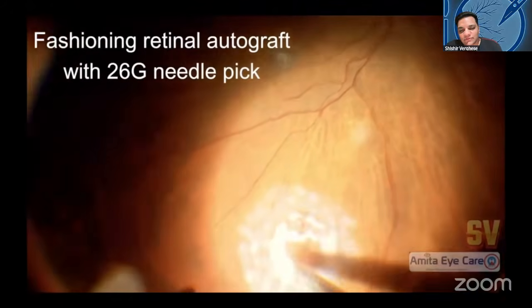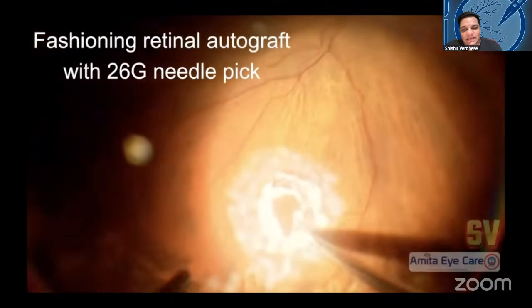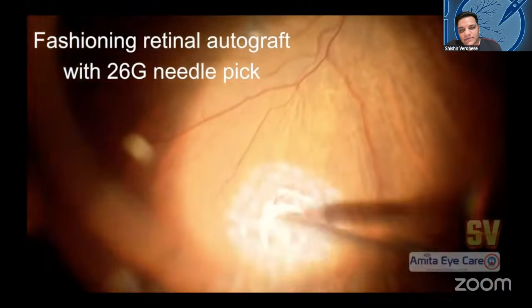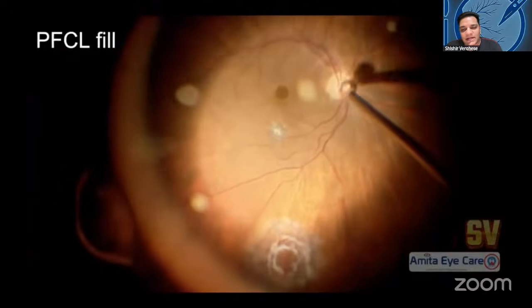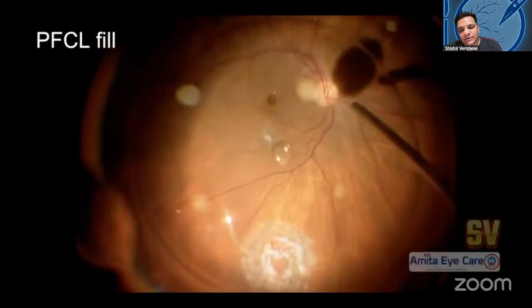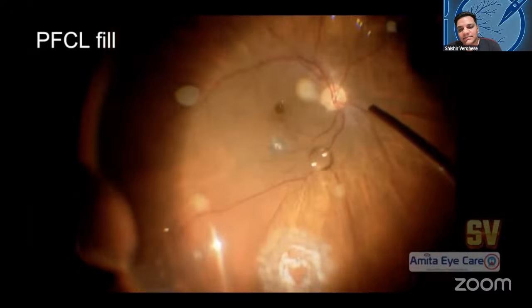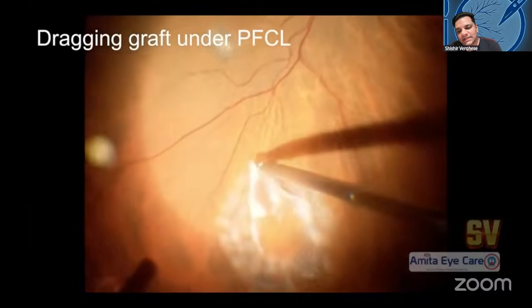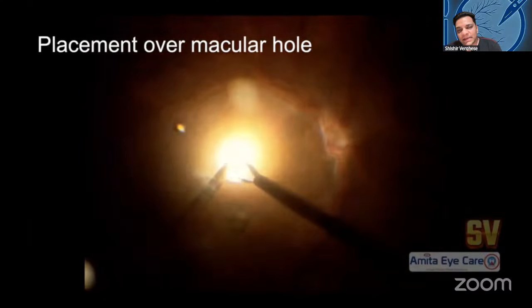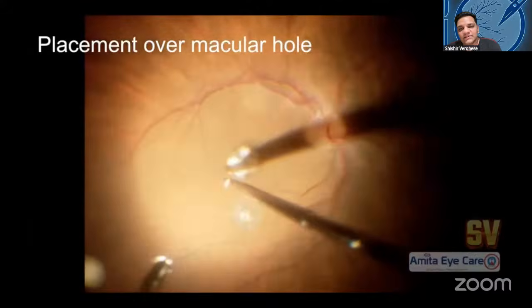And I don't have access to amniotic membrane like Dr. Avnish has. I only have the dried amniotic membrane. So here I'm using a pick to fashion an autograft after endolasering the donor site. I use a pick to fashion the autograft after cauterizing the retina there so it doesn't bleed. So deep cautery burns, and then I use a pick to fashion the graft. The graft should ideally be 500 microns larger than the size of your hole.